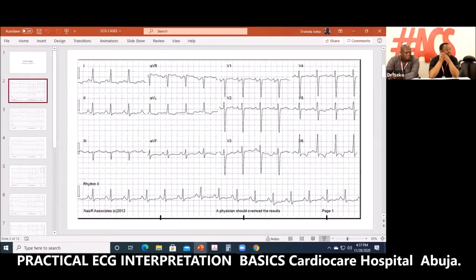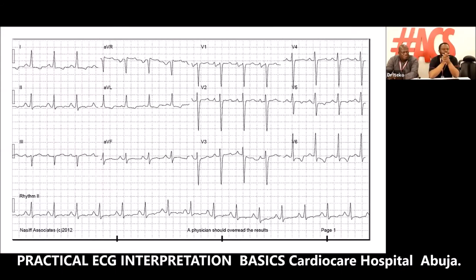So now look at this ECG we have. What is the reading? You can put your answer in the chat box. What is the reading of the ECG we are looking at on the screen now? Remember the five questions? Those in the studio, remember the five questions. Is the P wave upright in lead 2? Correct. Is it upside down in AVR? AVR is the second row on top. It's upside down. So that's the first question.